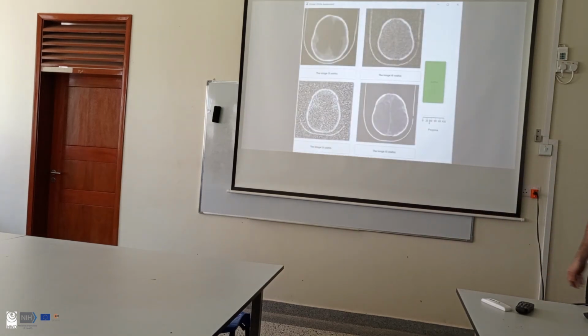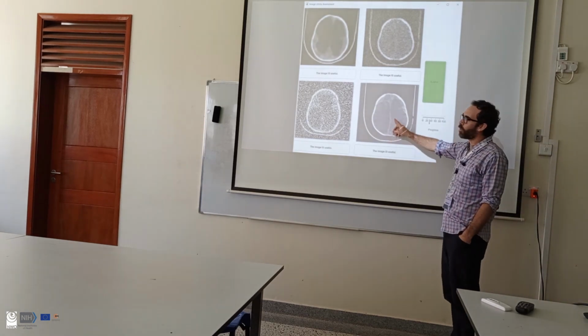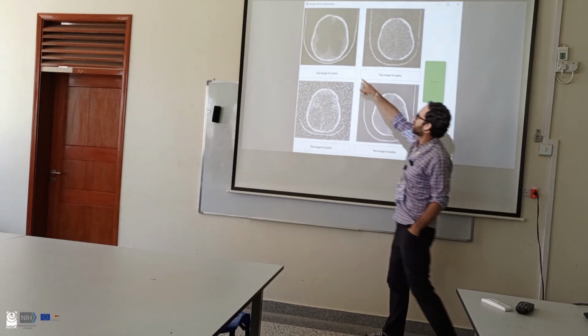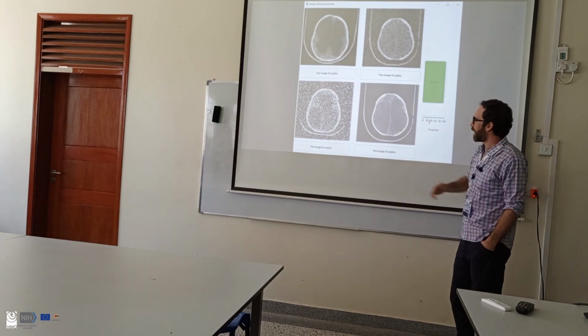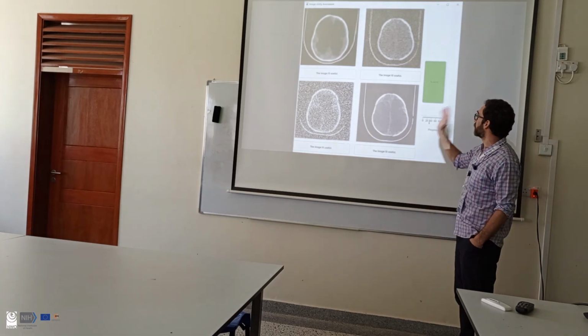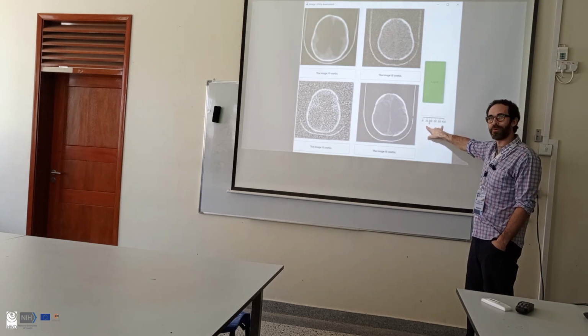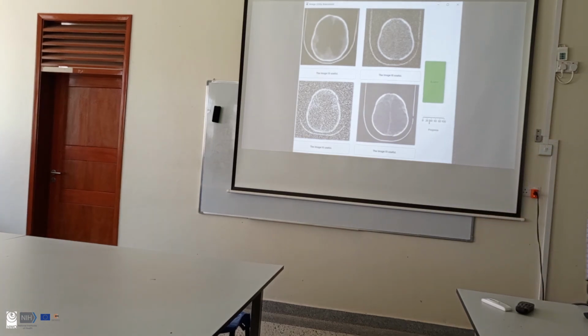This is what the panel looks like. I displayed 4 images at a time, and they didn't know it, but there was always one machine learned image in each panel that I showed them. So I think it was this image in this panel. Ahead of time, they didn't know that they were looking at machine learned images. I just asked them to click whichever one was useful. They would do that and submit it. And I put a little progress bar so they would have hope that this would end someday. It was very long. I think there were 420 degraded images and 140 machine learned images they had to go through. So this is what these guys said about these images.